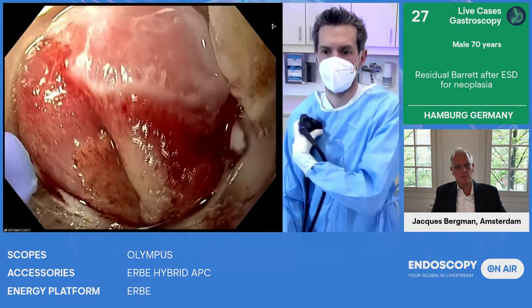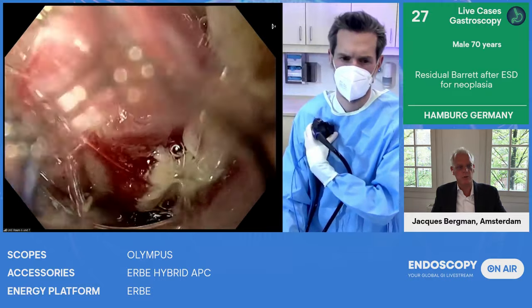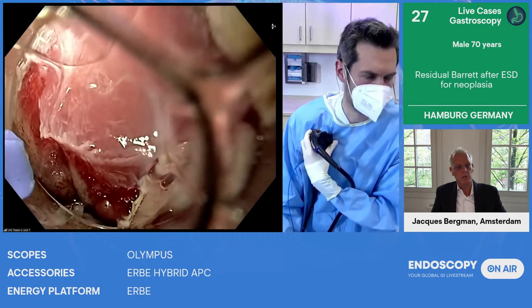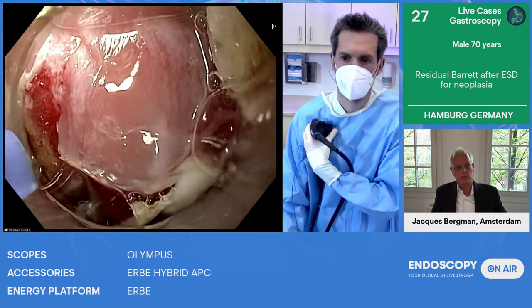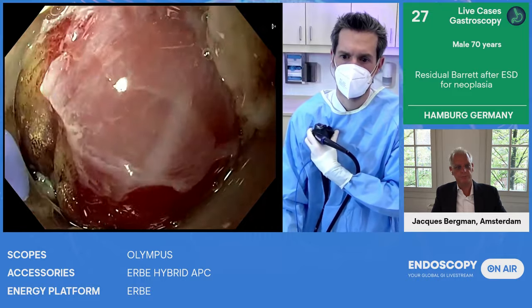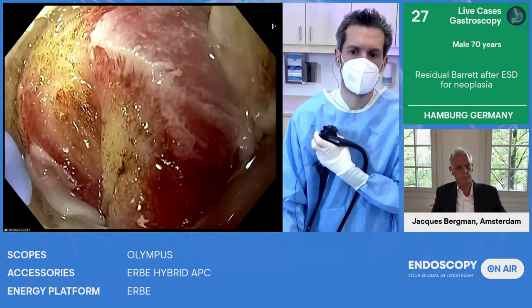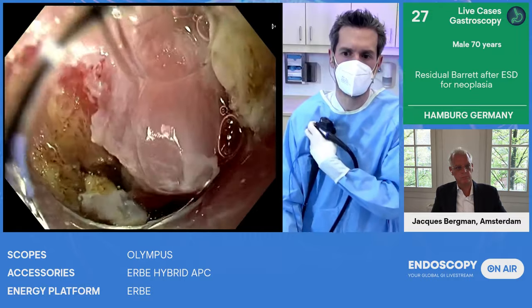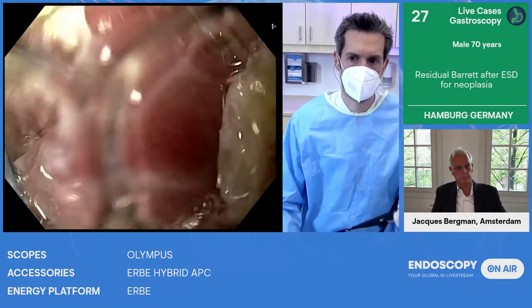The Barrett's is not very extensive. Do we really need the lifting, or could you just have ablated without doing the submucosal lift? Could you have done this APC ablation of these two small tongues without doing any submucosal lifting? Yeah, well, you could as well, but if you do the submucosal injection, you can use a little more effect with lower risk of thermal damage in the deeper layers and especially to the muscle layer. So that's why we use the injection.